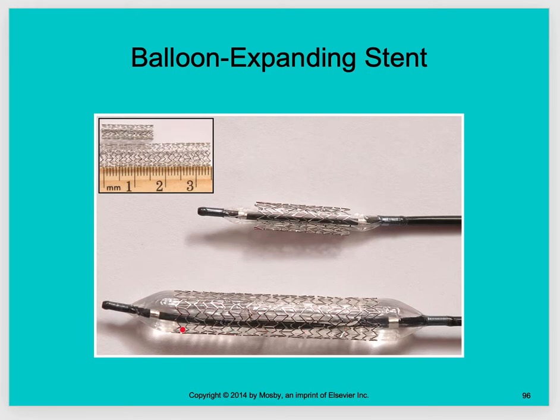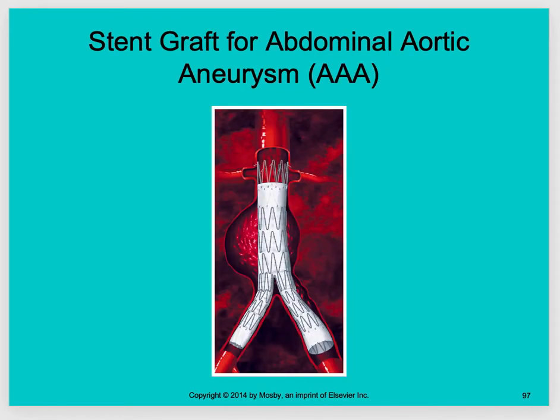It's going to go in. They're going to blow up the balloon. The stent's going to expand, and then they can retract that balloon. Sometimes that stent will stay in there. Sometimes they'll pull that stent back out, just depending on what they're needing to do with it.